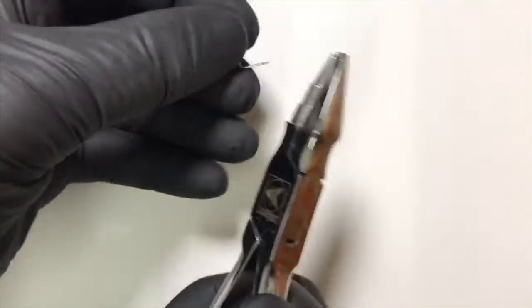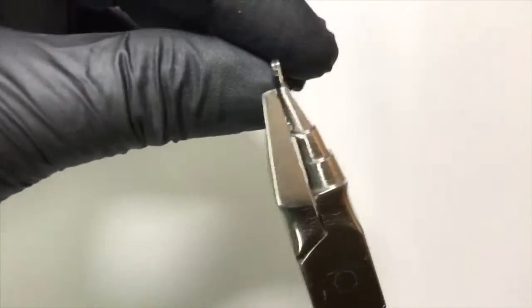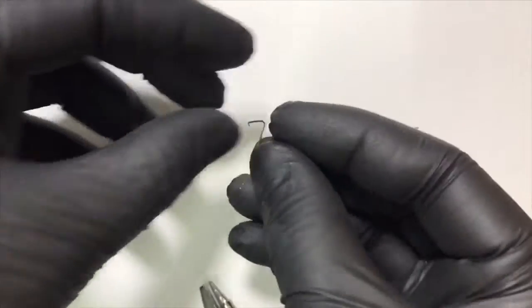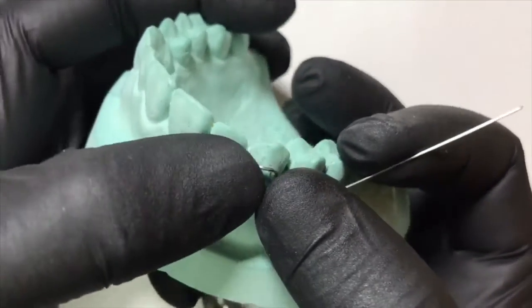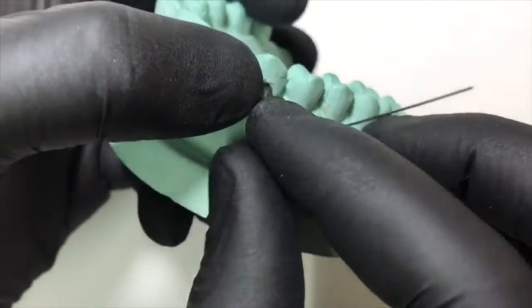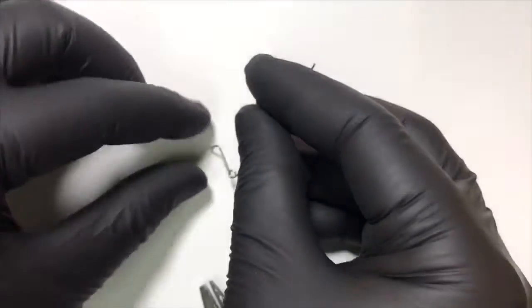We engage one end of the active arm in the sharp rounded beak of the universal plier and give a sharp rounded bend. Using the middle rounded part of the plier we follow the contour of the canine. We check its adaptation on the cast — it should follow the contour of the canine and the end of the active arm should be engaged in the embrasure between the lateral incisor and the canine. Now we proceed to the retentive arm.